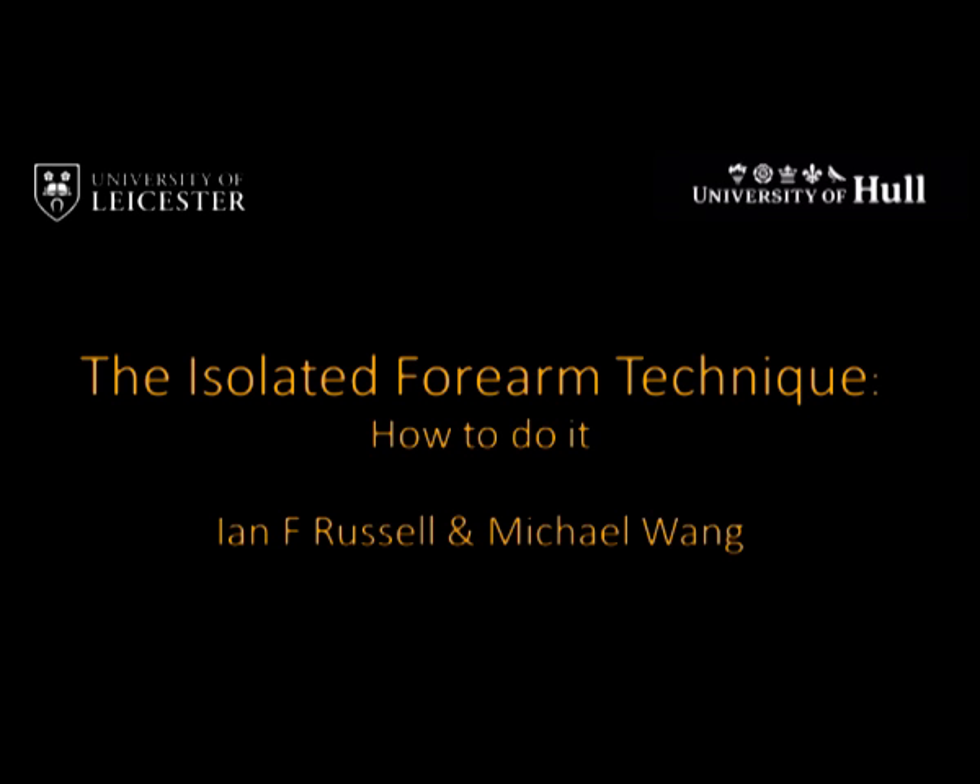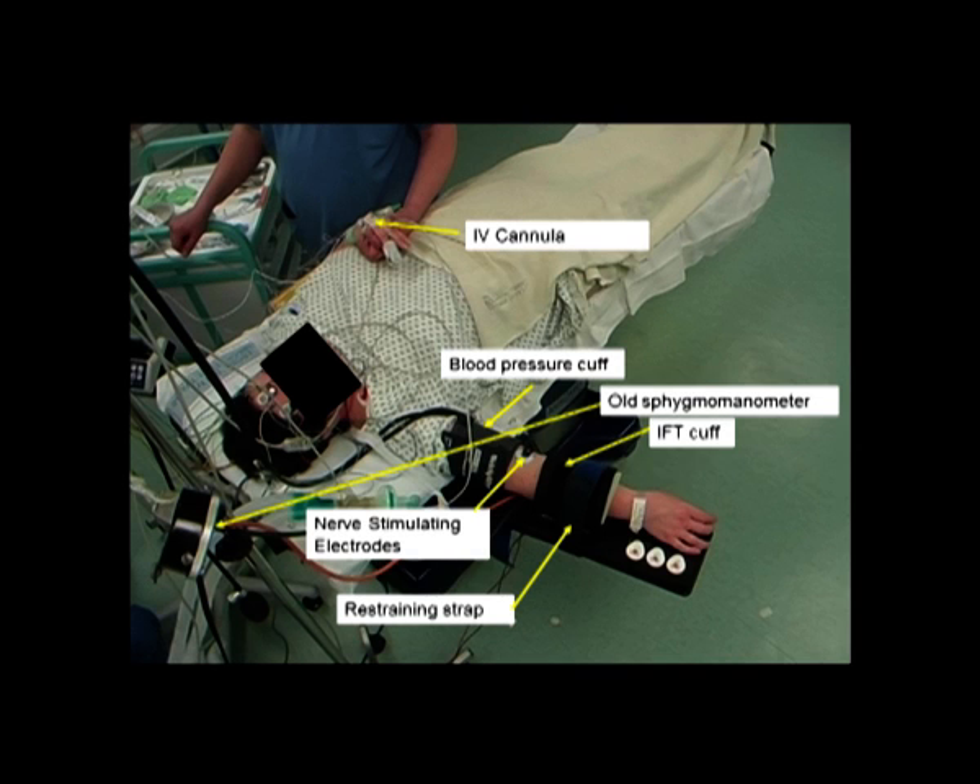This is a training video for anaesthetists interested in using the isolated forearm technique. You will need the following equipment: a pneumatic cuff, in addition to the standard blood pressure cuff for monitoring intraoperative BP, with a manual inflation bulb and manometer gauge to indicate cuff pressure.